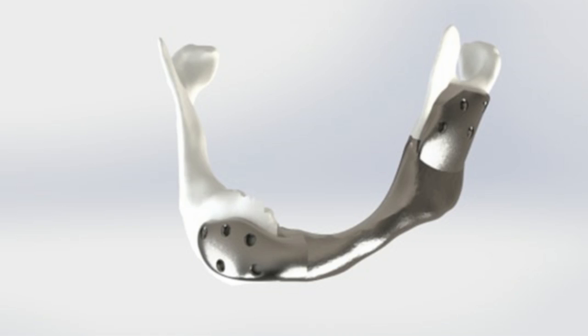The implant is much stronger, partly because the forces are optimally distributed with an improved fixation technique. The implant also has a so-called mesh structure on the inside.